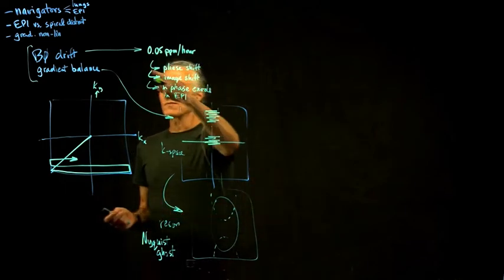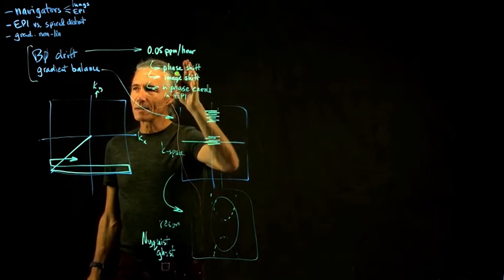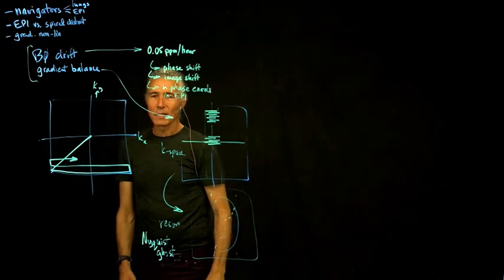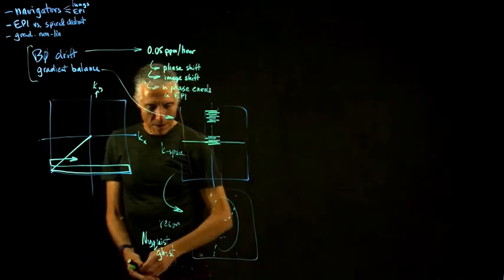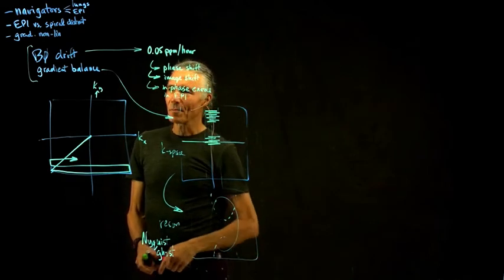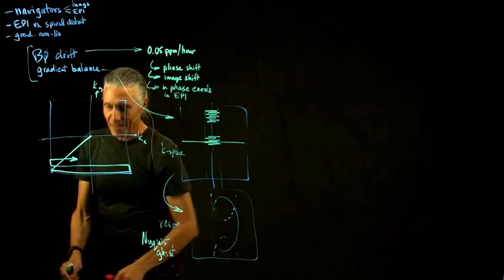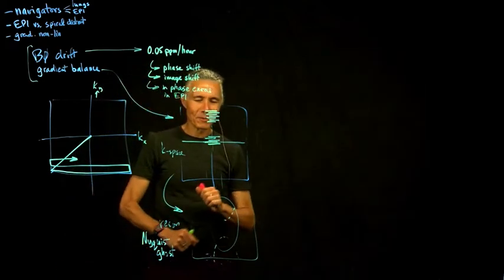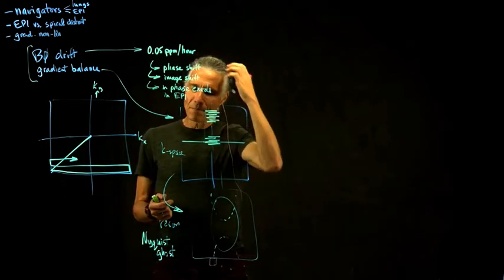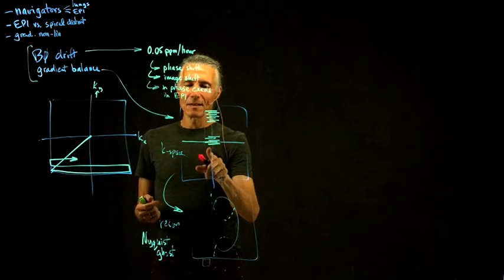In addition to this phase problem, because of the B0 drifting, the spins get out of phase from what we're expecting. So how is this done? Back in the day, when we had to walk 10 miles through snow to do our scans, at UCSD when we first bought Varian magnets, you just did this completely manually.